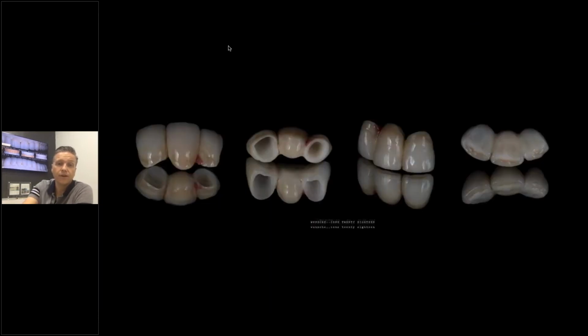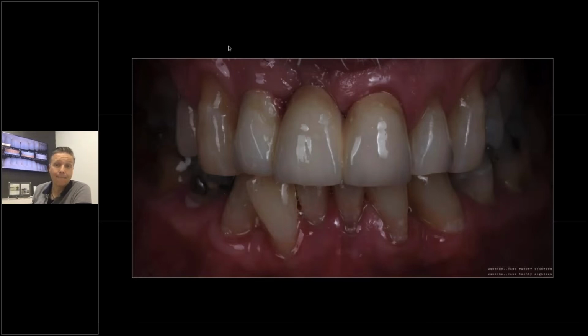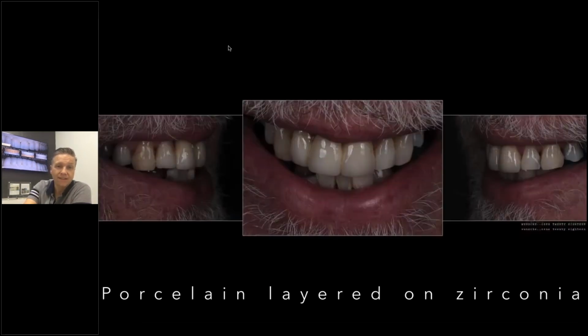When you see the bridge here from different angles, I also added a little bit of pink papilla in between because he had some recession, and that's how it blends in. This patient has most likely 25 different colors in his mouth, so for me that's even more difficult to match or blend than if it were just one or two colors. I think the result is definitely pretty nice. It blends in, it looks nice, and when you see the patient here, you wouldn't tell it's a bridge. It's his character, it's a mustache, and he has these different colors. That's everyday dentistry. Or something like this.